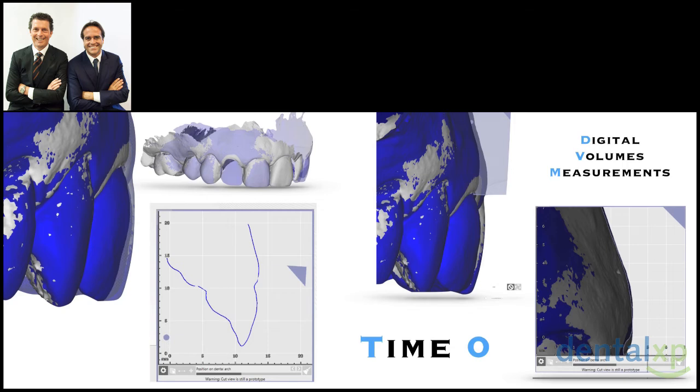And how can we do that? Digital impression once again is giving another tool, because look how we can standardize this measurement thanks to the intraoral scanners and the CAD software dedicated to this, if you obviously have a consistent digital tool.